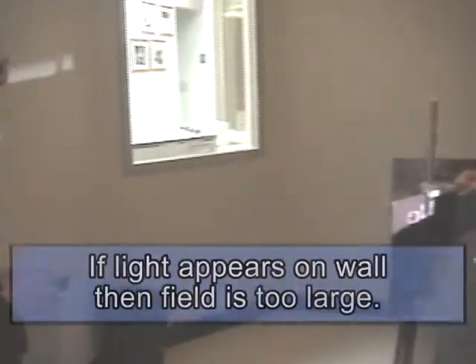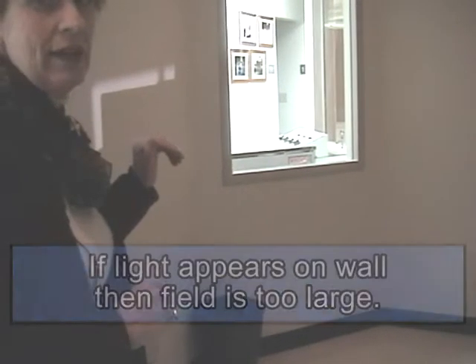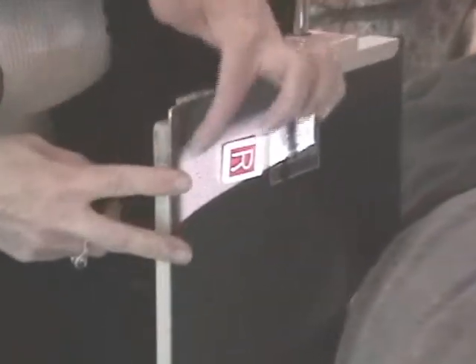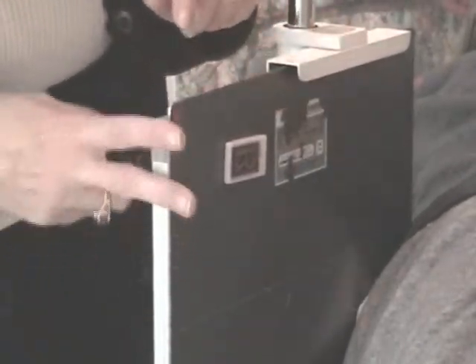And I'm going to have you look at the wall. Let the camera go on the wall there. If it's shooting on the wall, your field is way too big. You need to lower it back down. So if your light is too big, you can look behind it. It will be projected on the wall. You don't want that. You're going to have to come back in, bring it down, and then I have my R marker there, and I think the camera can see that. The ID blocker is right here, so I've moved the L marker or the R marker a little bit more superior because the ID blocker is right here, covered up by the grid.